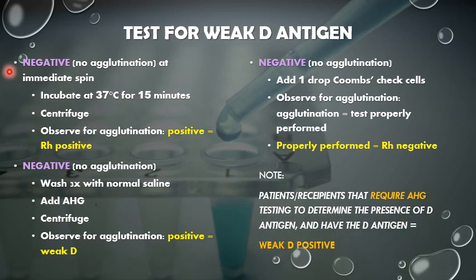Note, patients or recipients that require AHG testing to determine the presence of D antigen, and have the D antigen, are the weak D positive.